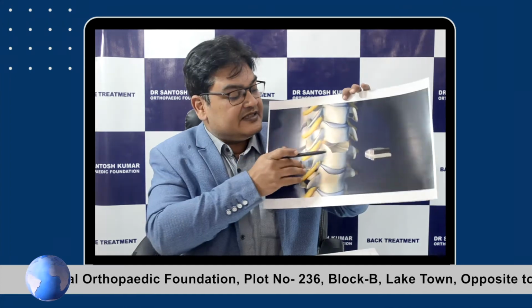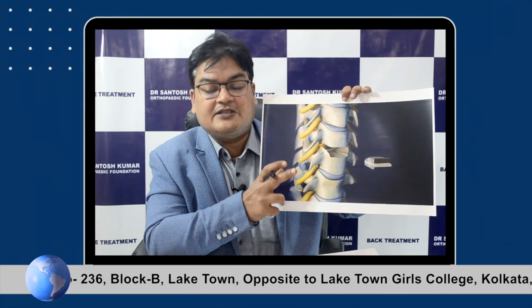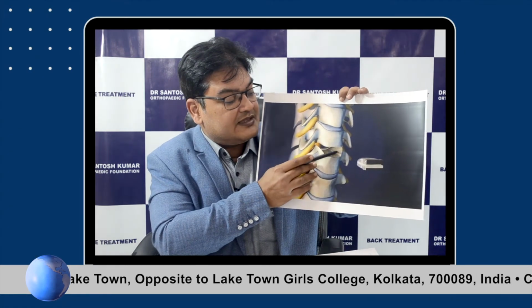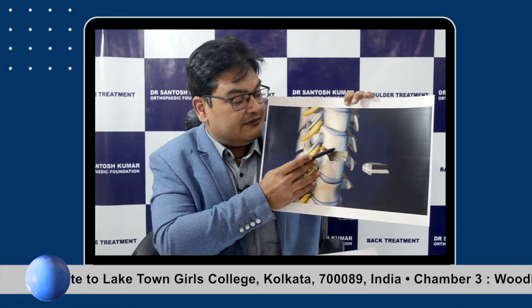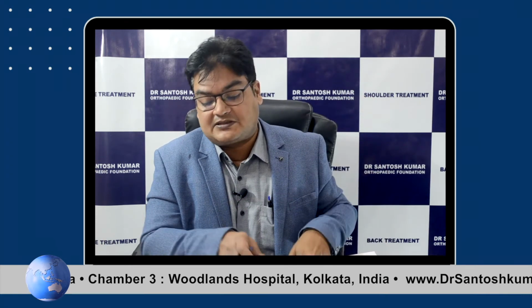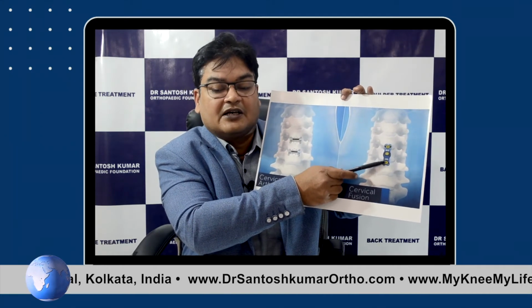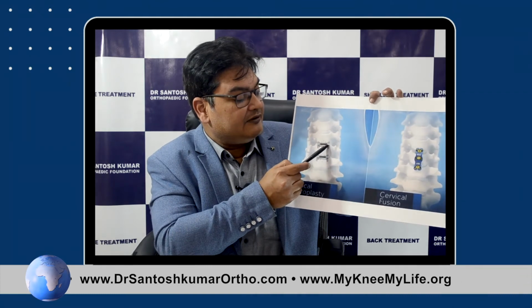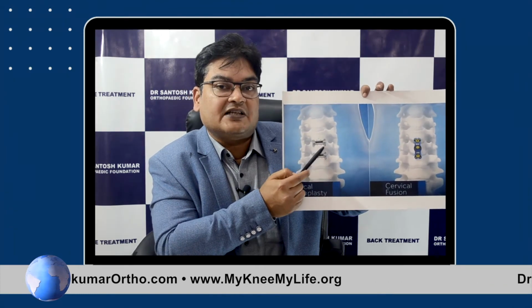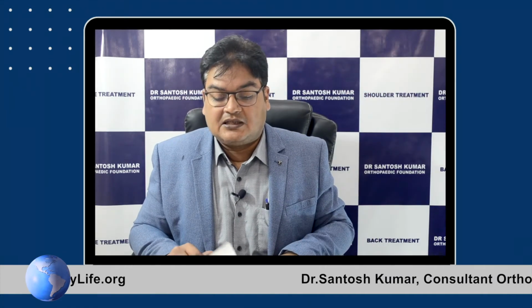Most of the times this diseased disc, this affected disc, is removed, and we have 2 options. One is to fuse it, means we remove the diseased disc, we decompress the nerve root, and then we put a spacer and filler and we fuse it. And the second option is we replace it, which is known as disc arthroplasty. We remove the diseased disc and put an artificial disc there. Putting artificial disc is disc arthroplasty. Now this is how it looks in X-ray.